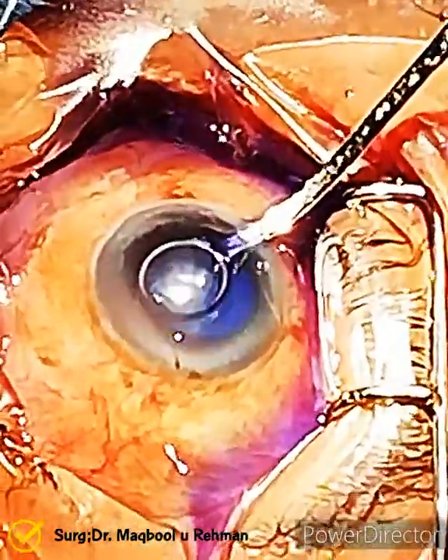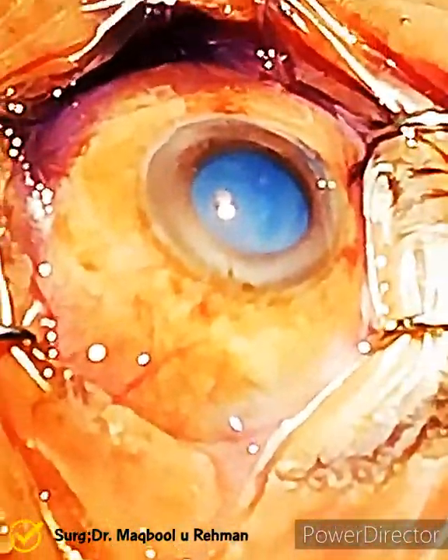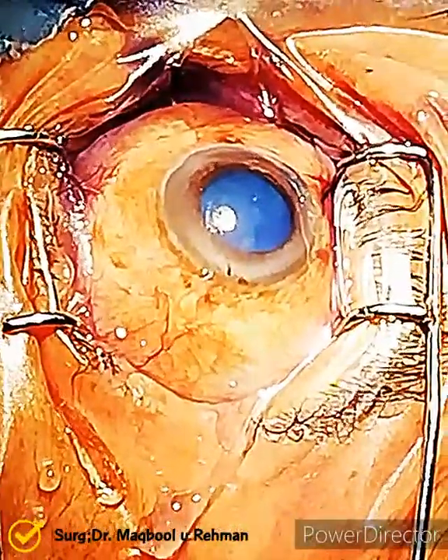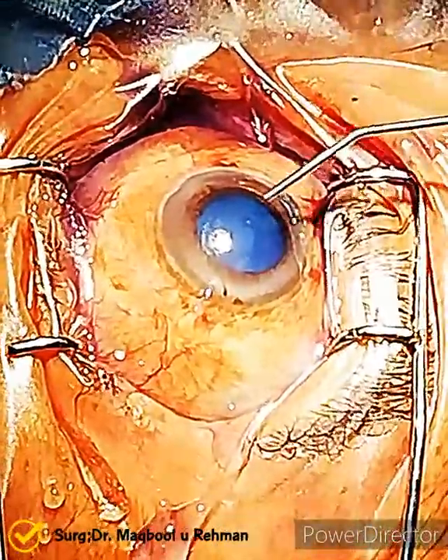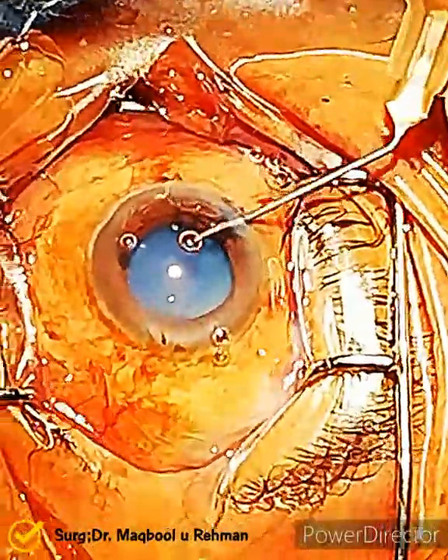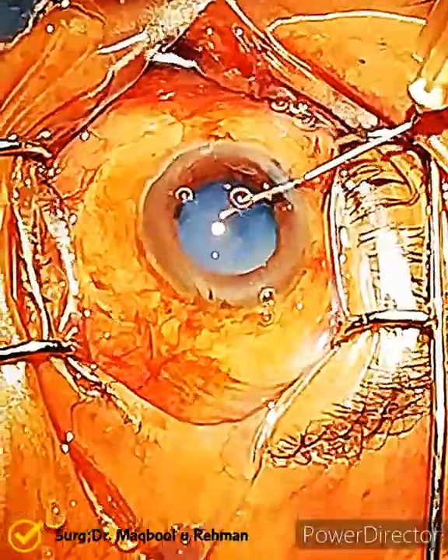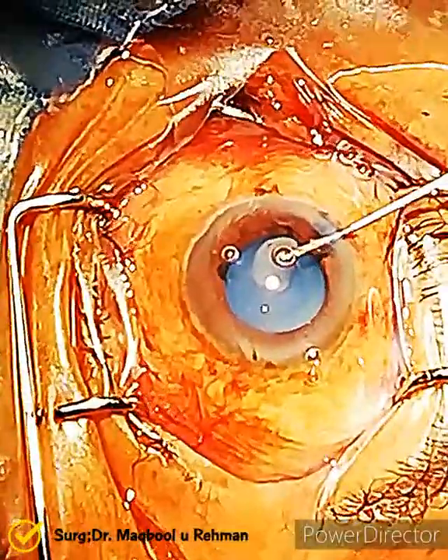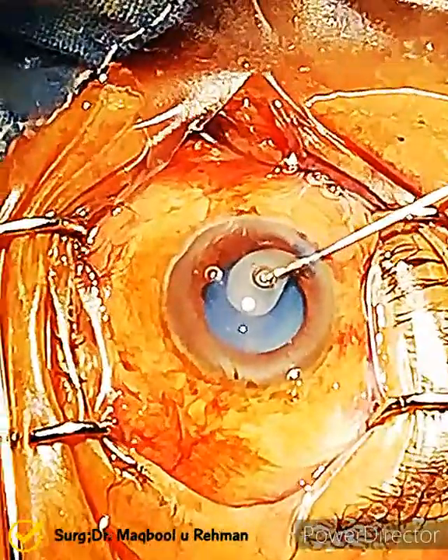Trypan blue dye has been injected into the anterior chamber. The surgeon is trying to remove the air bubble. In intumescent cataract, the capsulorrhexis is a very difficult job, but good luck for the surgeon. He is using a cystitome, trying to give a nick into the anterior capsule. The white fluid came out of the bag — almost all the cortical matter has been liquefied.